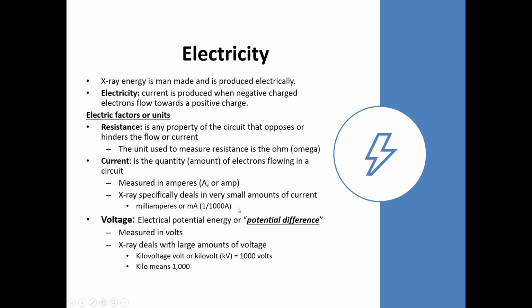And then moving on, this will be kind of closing the rest of the lecture. We're at 36 minutes, should be done by 45 or so. So electricity: we produce X-rays using electricity. So it's an energy change of form. We're starting with electrical energy. We're going to finish with electromagnetic.